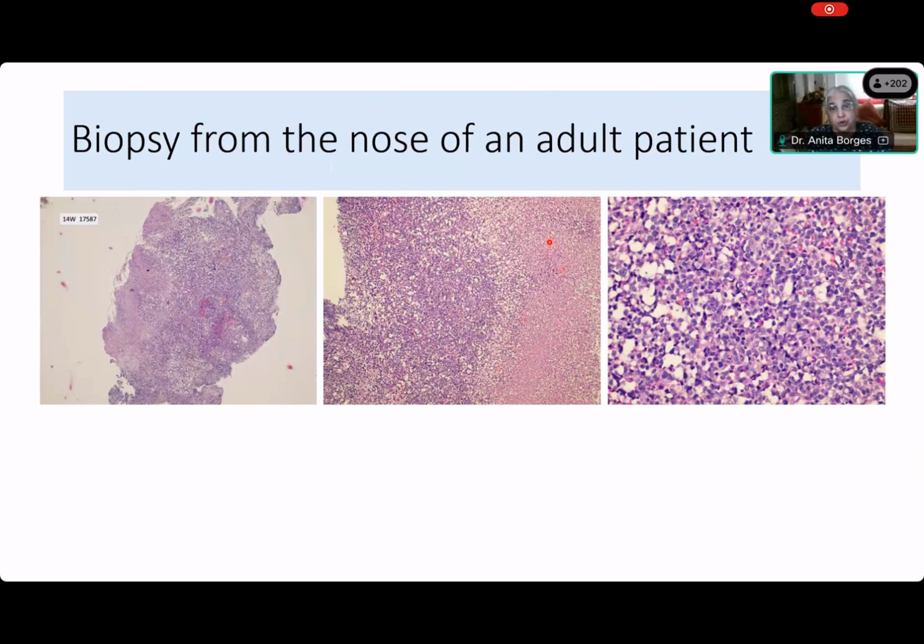There's a lot of necrosis, which you see in this middle. It is in sheets and it is round cell. Yes or no? Yes, ma'am. It lands on your desk and you see this H&E. What do you want to say that I got on my microscope slide? A poorly differentiated malignant tumor with a round cell morphology.